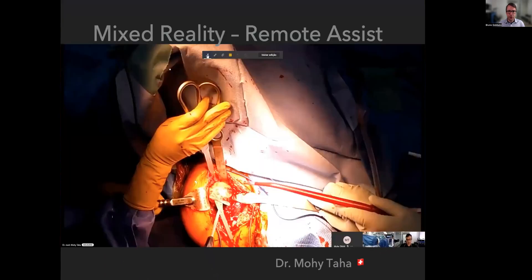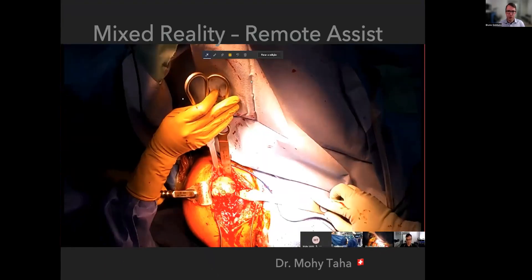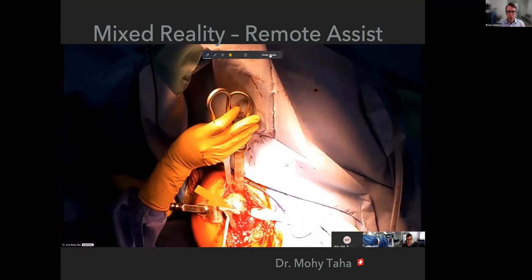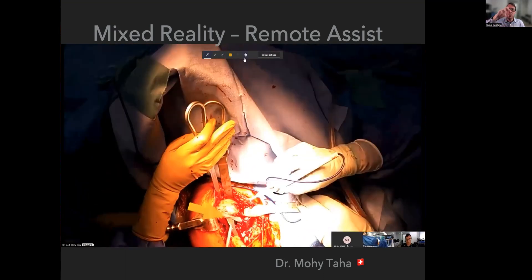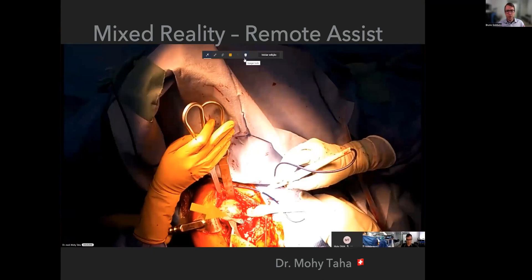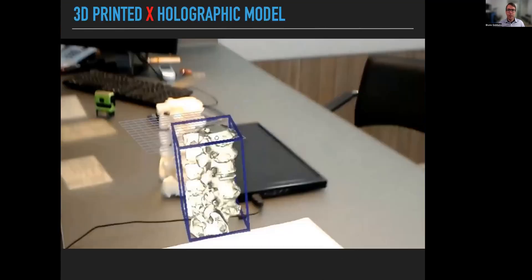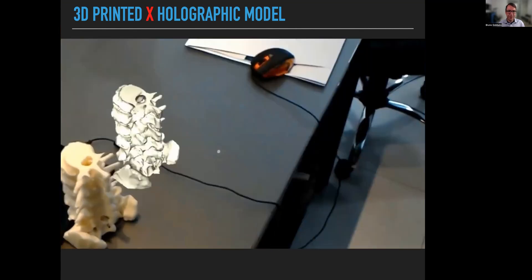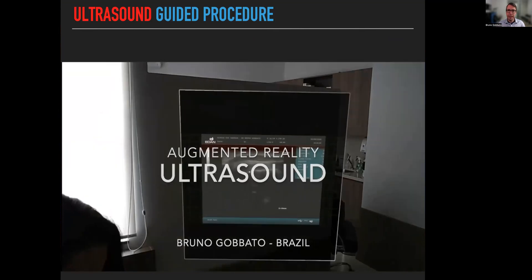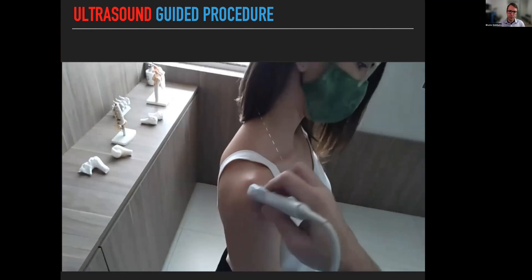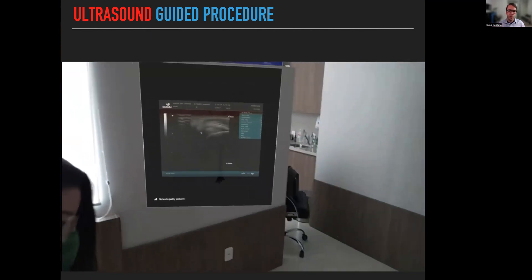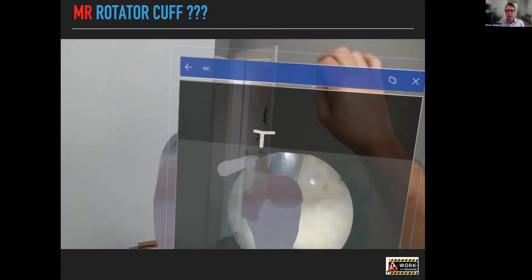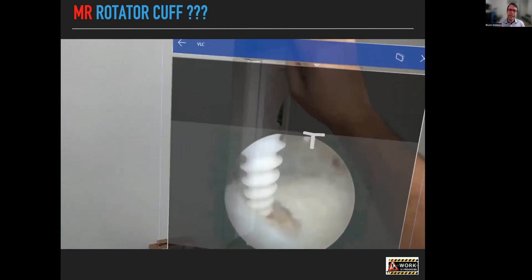We can also do remote assist. In this case, a surgeon in Switzerland — Mohy Taha — and in my computer I'm putting an arrow where he should place the osteotomy, and that arrow is placed in his field of view, glued to the humeral head, so he knows where to do the osteotomy. This is also an example of how we can compare a 3D printed model and an augmented reality model — they are very, very similar. We are also trying augmented reality ultrasound from my home office, thinking about future procedures using ultrasound and augmented reality, and also for arthroscopy. This is us just testing this kind of technology — it's not ready yet.